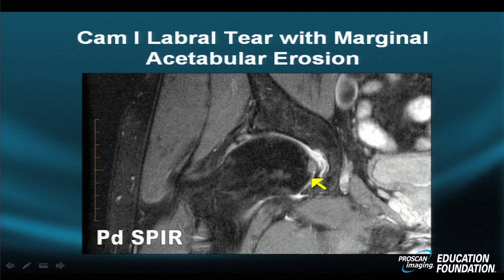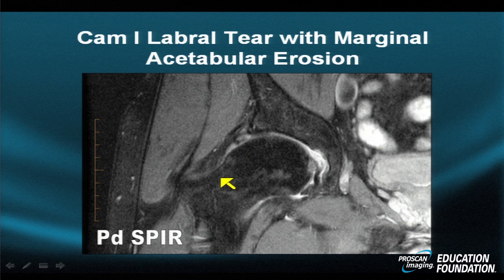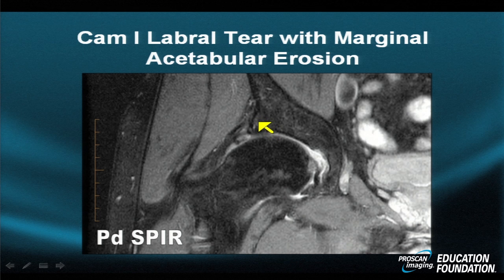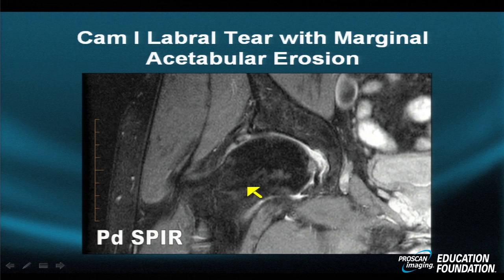Here's an example of a patient with FAI 1 or cam-type impingement. One of the first things to happen with this loss of sphericity of the femoral neck — the lack of tapering, which sometimes may even be convex outward — is a labral tear with change in the hyaline cartilage. Look at the alteration in signal of the hyaline cartilage as we move from medial to lateral. We see a spur and a small subtle osteodematous stress reaction with a macerated labrum that looks swollen, not maintaining its normal triangular, relatively homogeneous dark signal intensity.